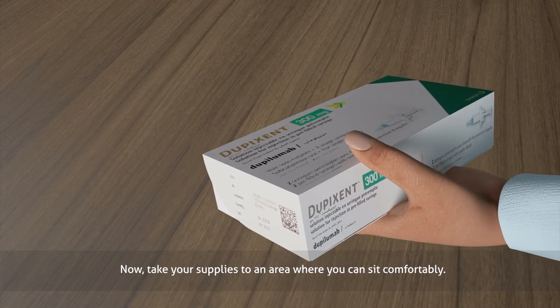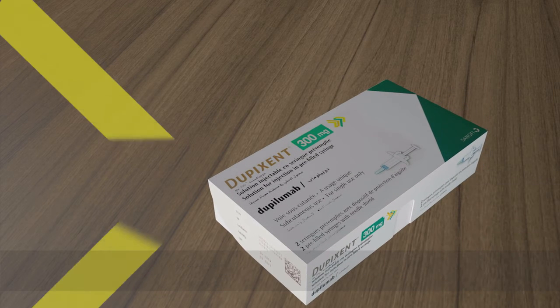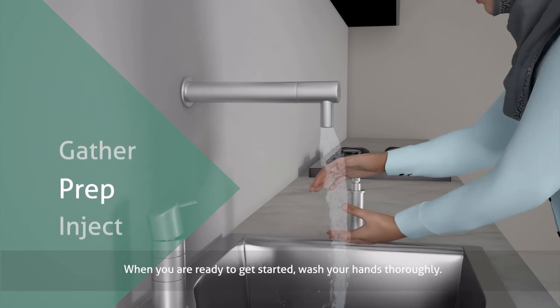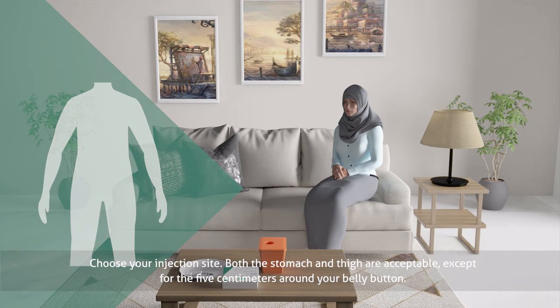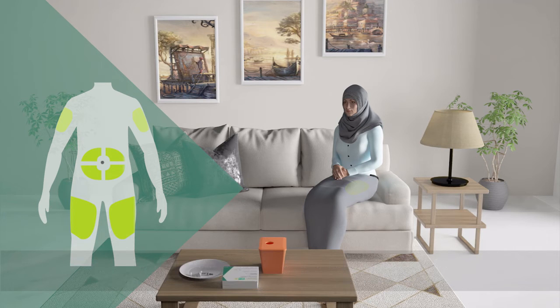Now, take your supplies to an area where you can sit comfortably. When you are ready to get started, wash your hands thoroughly. Choose your injection site. Both the stomach and thigh are acceptable, except for the 5 cm around your belly button. If somebody else gives you the injection, the outer area of the upper arm is also an option. The person giving the injection should follow the same preparation procedure.